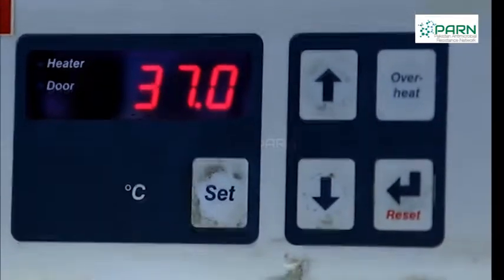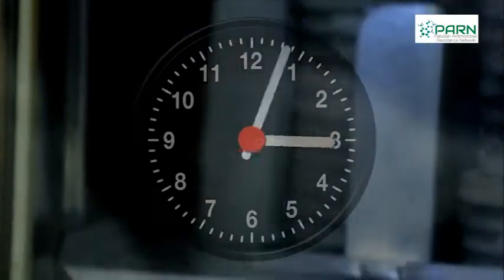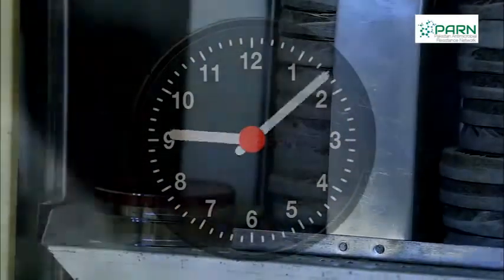Incubate at 35 to 37 degrees Celsius for 18 to 24 hours or according to organism's growth requirements.